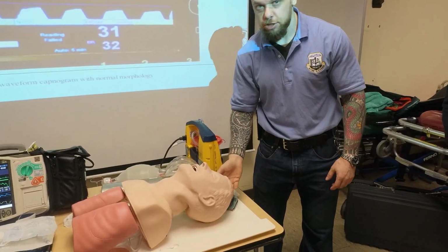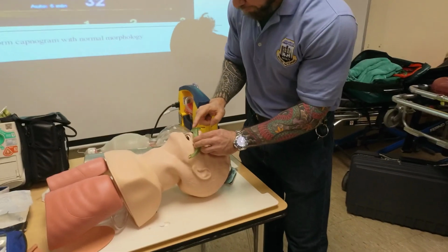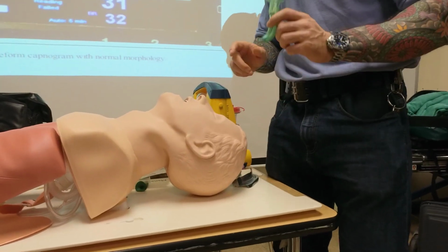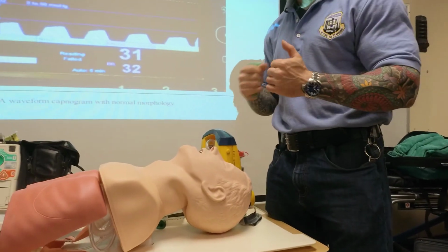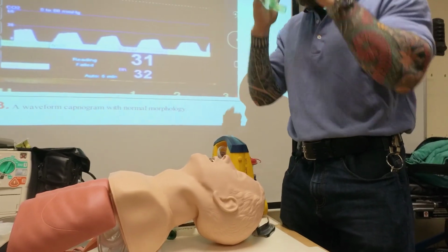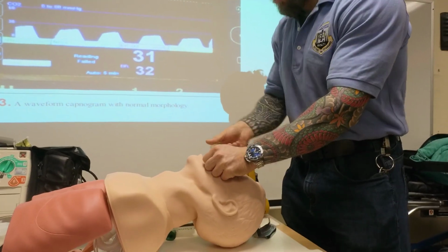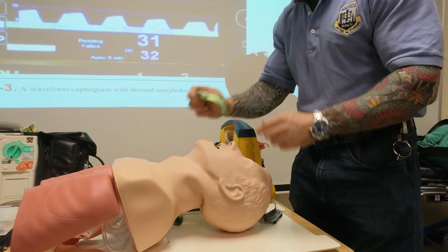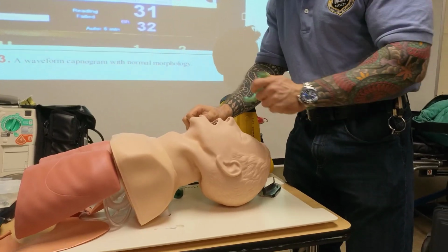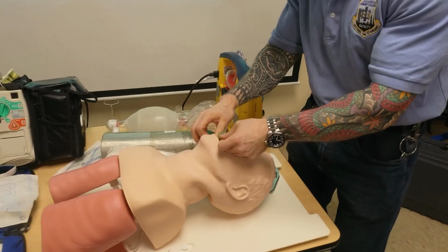What you're going to do is initiate your BLS procedures first. You will measure the OPA: central incisors to angle of the mandible. For this, I'm not wearing any PPE. What the PPE should be is gloves, face protection, and eye protection. Very important. You open the mouth and insert the OPA. The technique I prefer is I just use my thumb, then I insert, and then I twist. Why do I do this? I don't want the patient to chomp down on my fingers.